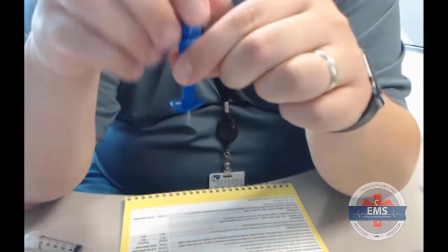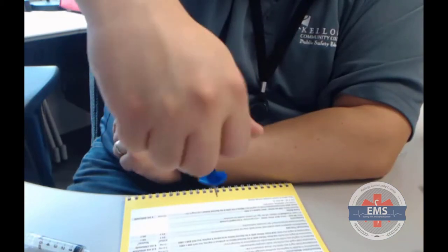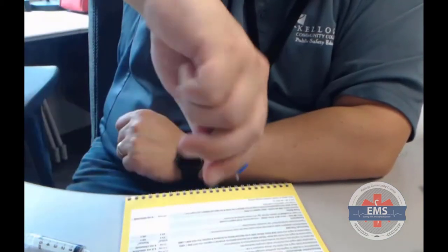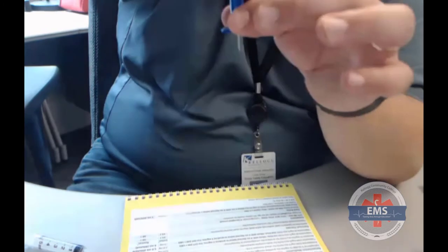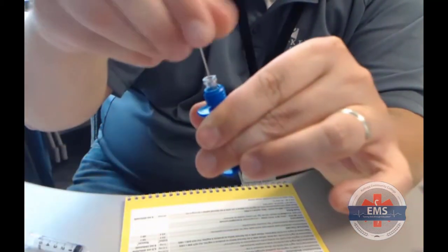Again, once the needle is in position, you're going to put it in at a 90-degree angle and twist in a rotating motion. Try not to sway your arm back and forth; keep it nice and still. Then you should feel a pop once it's in. Once that's in, I can go ahead and unscrew my cap and remove my stylet.